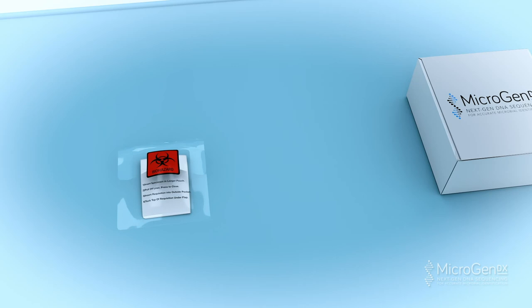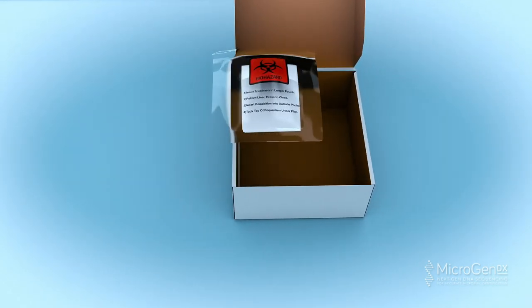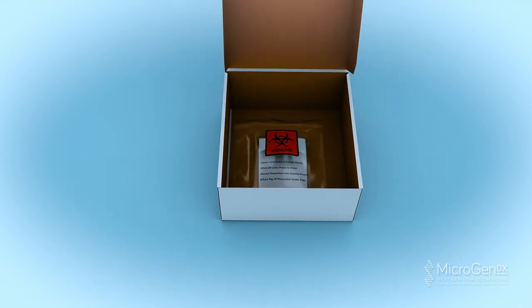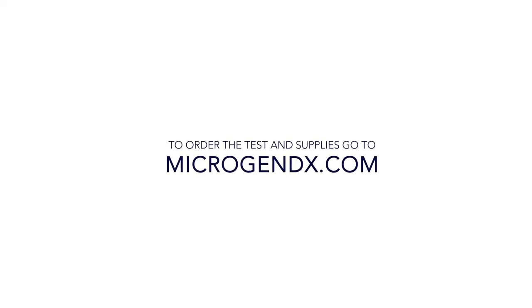Place the sealed bio bag into the MicroGenDX prepaid shipping box and send out according to your facility protocol. Alternatively, take it to the nearest FedEx Dropbox. To order the test and supplies, go to MicroGenDX.com.